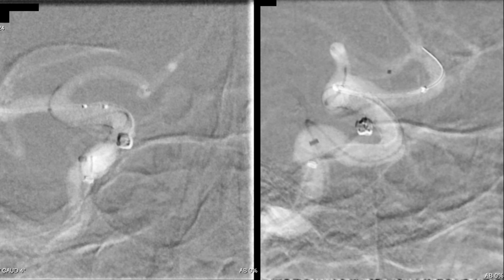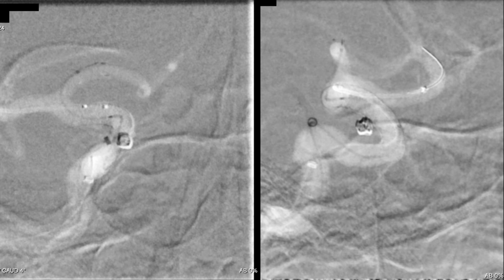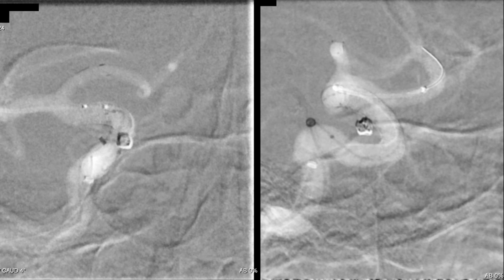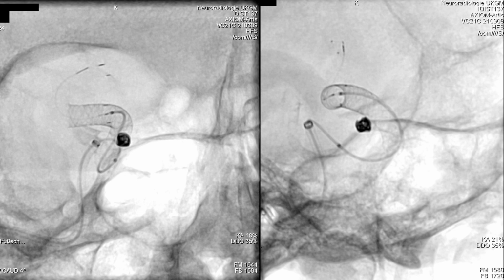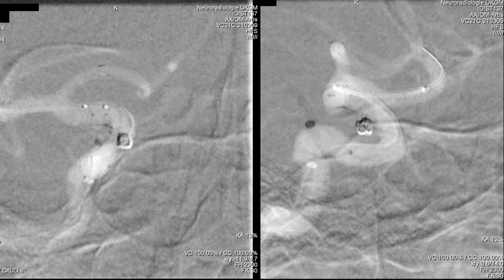It has two markers, a distal one and a proximal one. We will take the microstent a little bit proximally so that we can see this C shape. And now we are starting unsheathing the microstent. And now we're reaching the proximal end, and that's how we've implanted the microstent. And now we can take our microcatheter and the pusher of the microstent out.